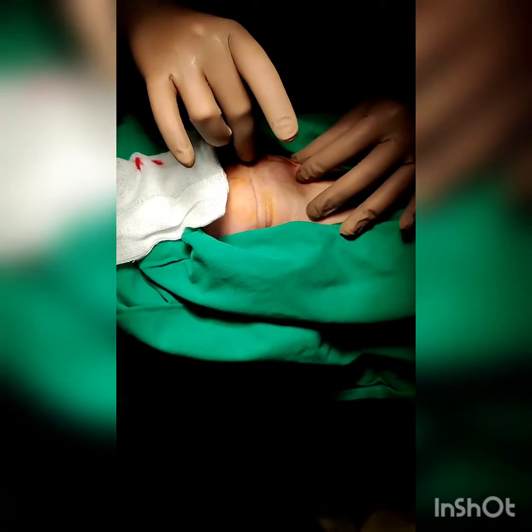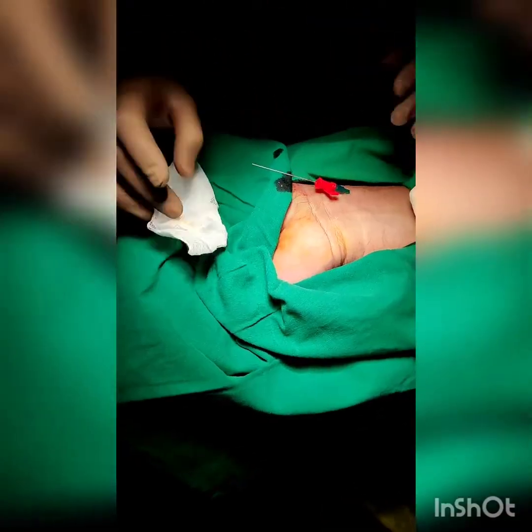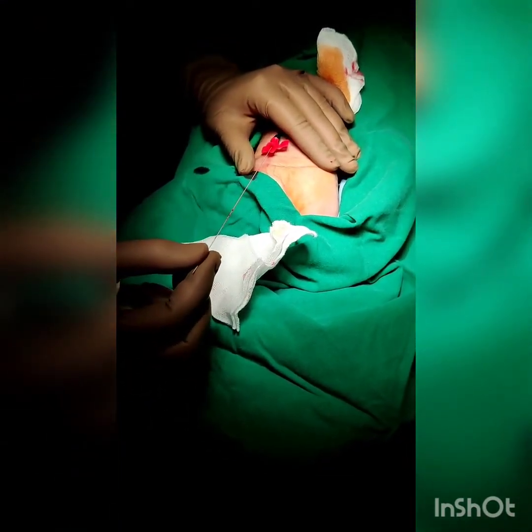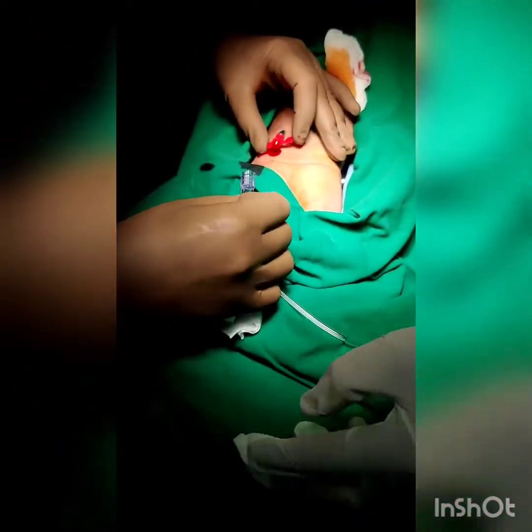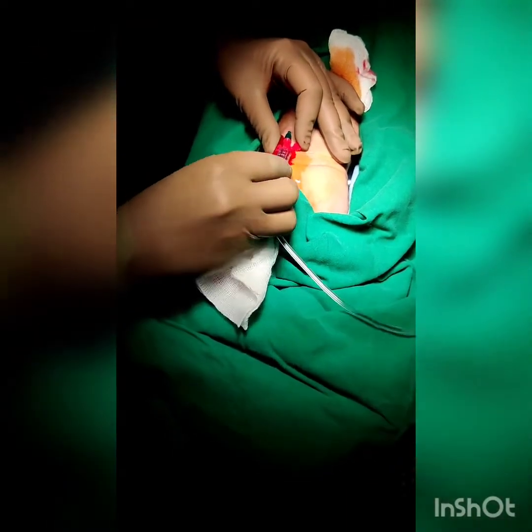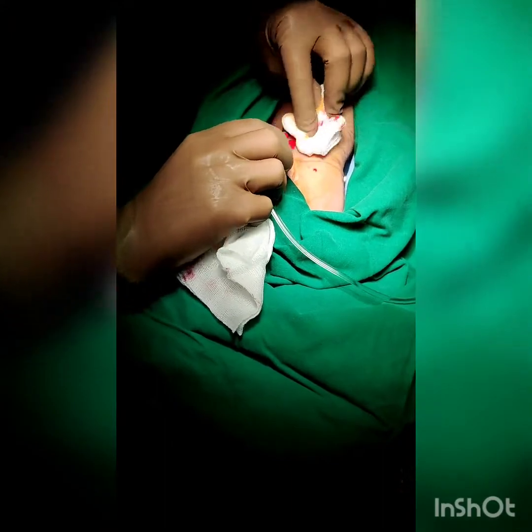The guide wire is removed and the pulsatile flow of blood from the radial artery is confirmed. The saline flush tubing from the transducer set is then attached to the arterial catheter and screwed well to prevent any leaks.